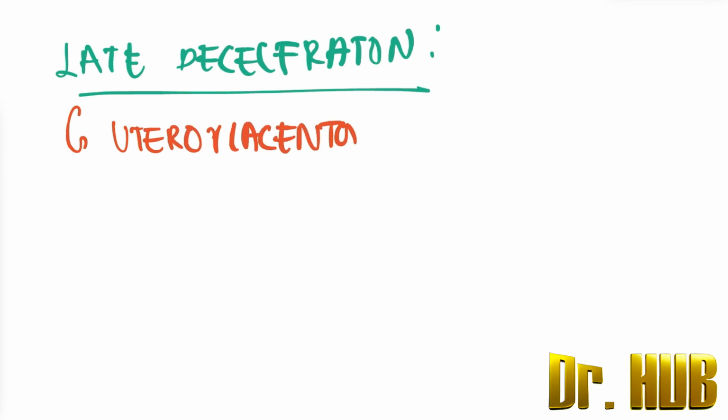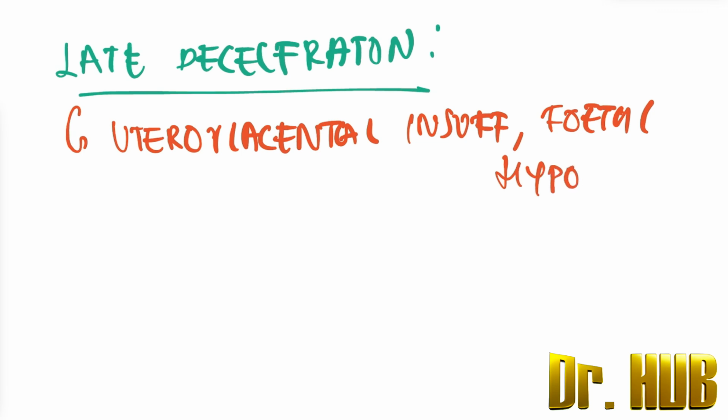So it is seen in terms of the uteroplacental insufficiency as well as the fetal hypoxia. So you can represent it like this if there is a late deceleration phase.